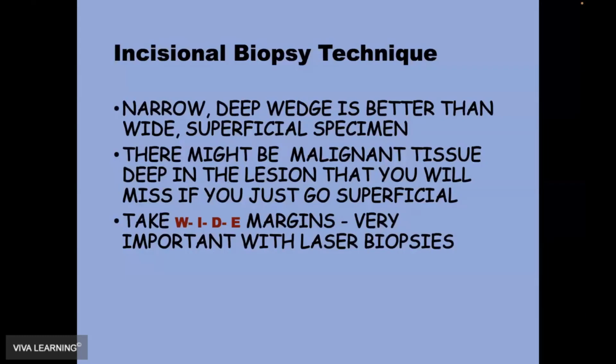You can take a narrow, deep wedge or a wide but shallow wedge. You always want to take a narrow, deep wedge. Narrow and deep is better than wide and superficial, for the simple reason that there may be malignant tissue deep in the lesion that you'll miss if you go superficial.